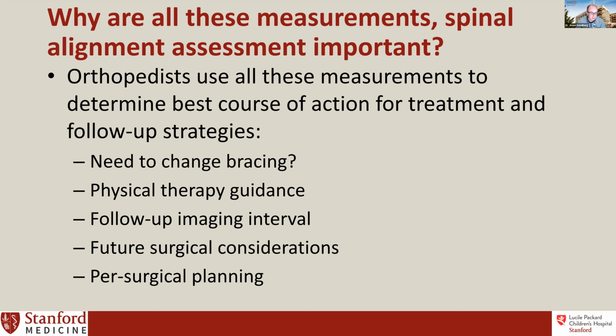And some of these questions: does the brace need to change? Does the physical therapy guidance need to change? Does the follow-up imaging interval need to change? Might think about surgical considerations. And of course, for pre-surgical planning, if that's the route that is going to be taken.